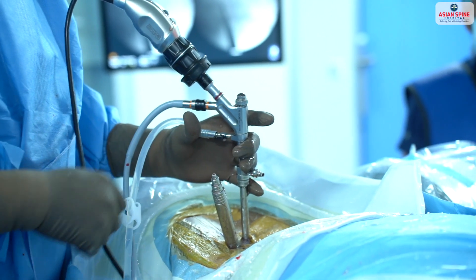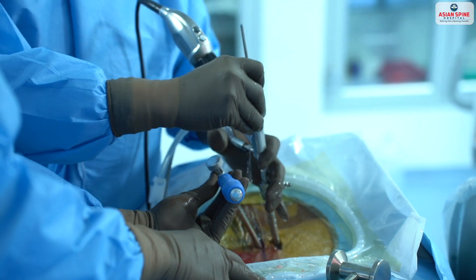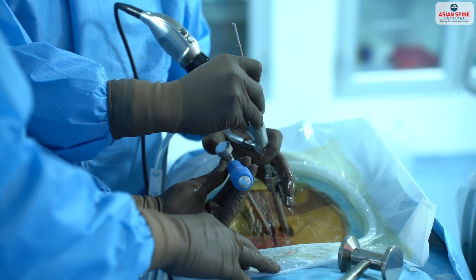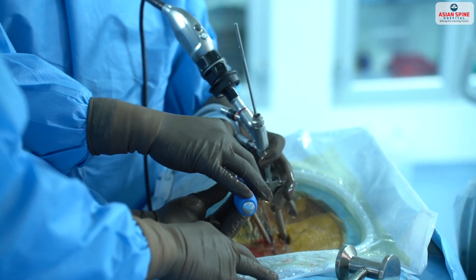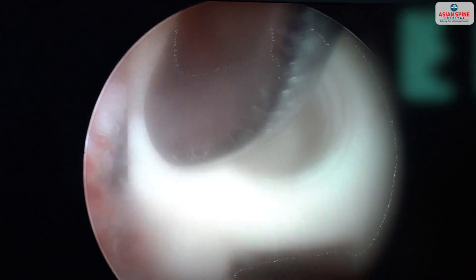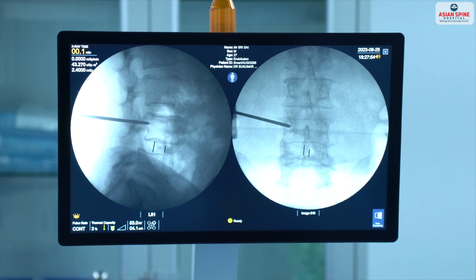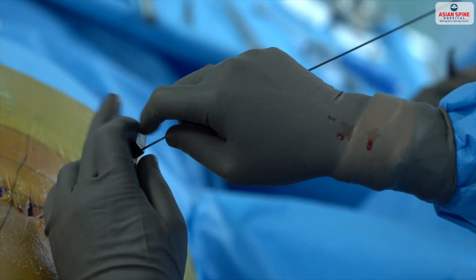Serial dilators are placed to have an advantage when placing the cage — they dilate the muscles so the cage goes inside very easily. Once the dilators are in place, I take a dissector, viewing the thecal sac with my scope, retract the nerve root, and place the cage through the dilated corridor.